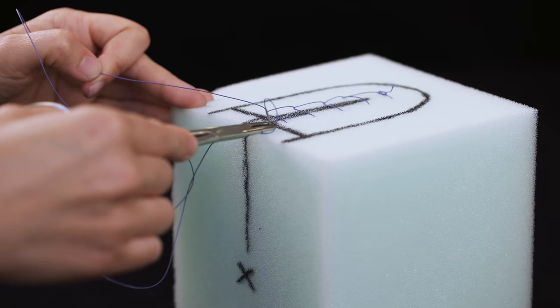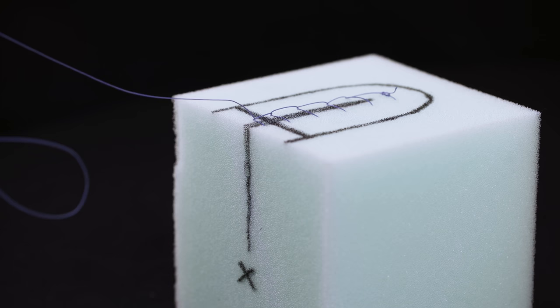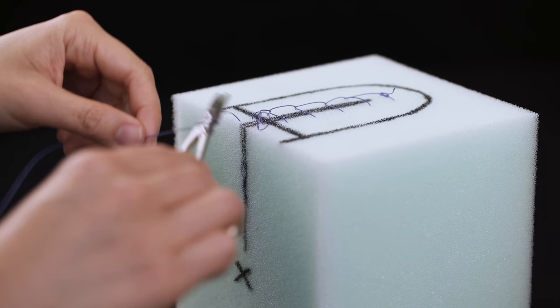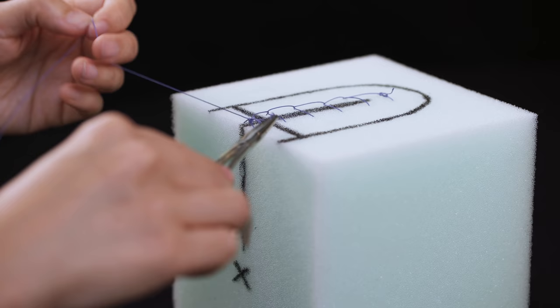I will place one suture on the inside of the hymen and then the next set just outside of the hymen, so I have perfect re-approximation of the hymen. I will end my vaginal layer about one centimeter past the level of the hymen and tie the suture to itself. When I cut the suture, I'll leave a small tail to come back to later.